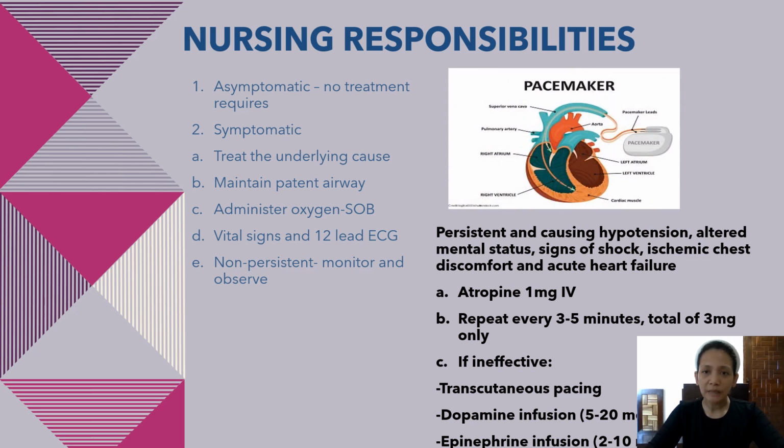And this image is a pacemaker. This is a permanent pacemaker, which is battery-operated, connected to electrodes placed in the chambers of the heart, either single chamber, dual chamber, or biventricular, to regulate the SA node. It's actually to replace the damaged SA node that's not working properly. This will be the heart's pacemaker and will control the heart rate and reduce the mortality, comorbidity, and complications related to sinus bradycardia.